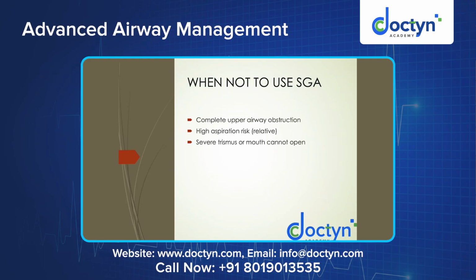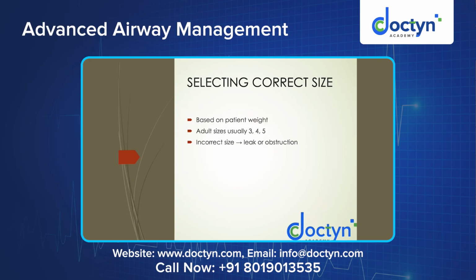In these cases, the supraglottic airway will not open up the airway. So that's why you avoid supraglottic airway in those patients. Selecting the correct size always depends on the patient's weight. There are usually 3, 4, 5 sizes. Incorrect size again leads to a leak or obstruction.